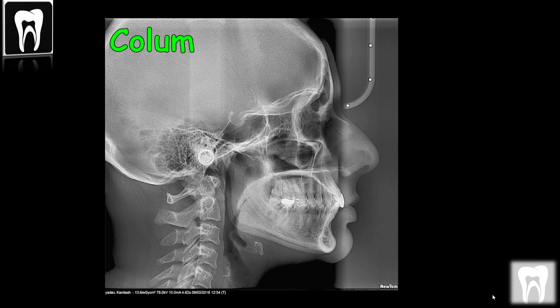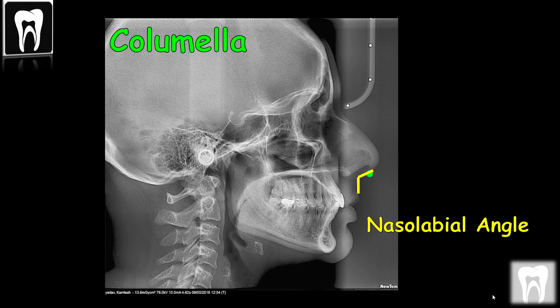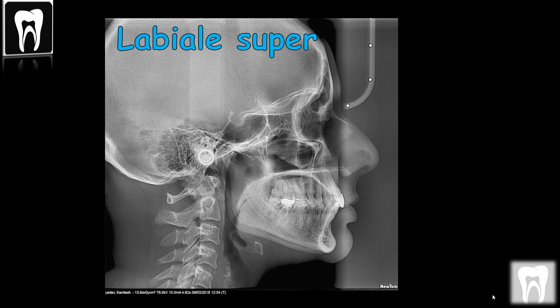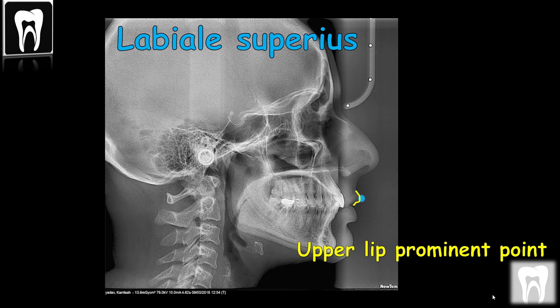Columella is the inferior point on the soft tissue contour of the nasal labial angle. It reveals the anterior part of the angle. Subnasal is the midpoint on the nasal labial soft tissue contour between the columella crest and the upper lip, or the vertex of the nasal labial angle. Labial superius is the midpoint of the vermilion line of the upper lip, or the most prominent point of the upper lip.